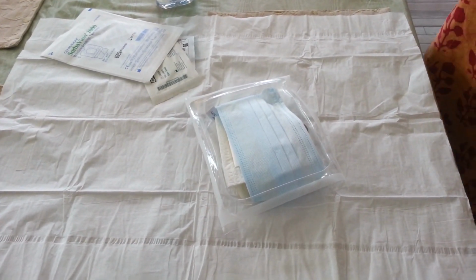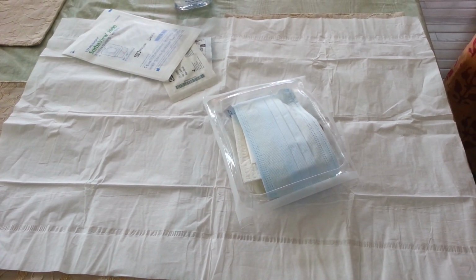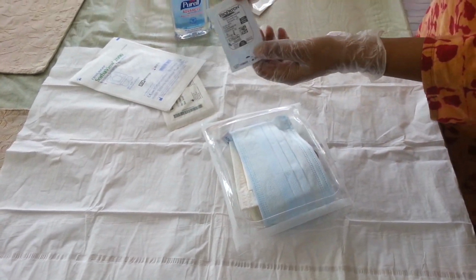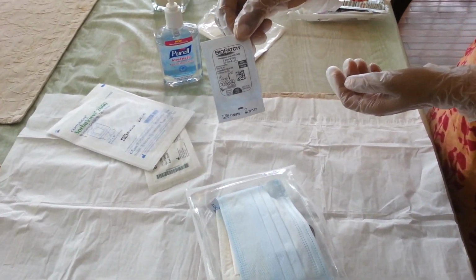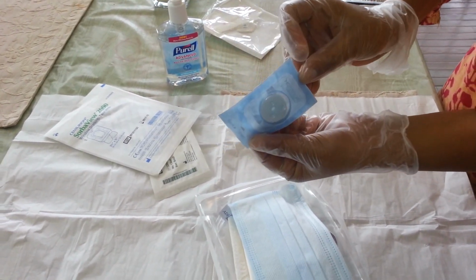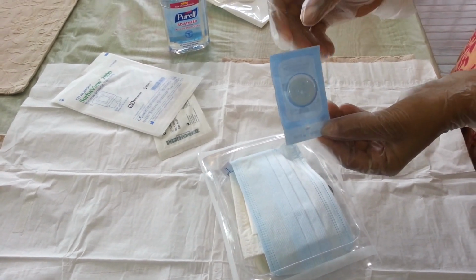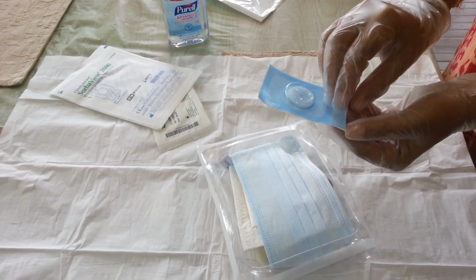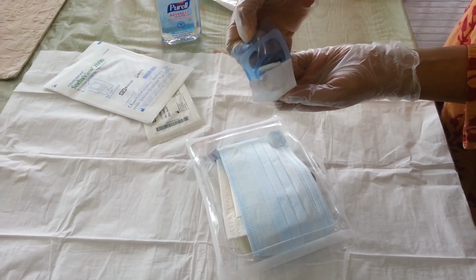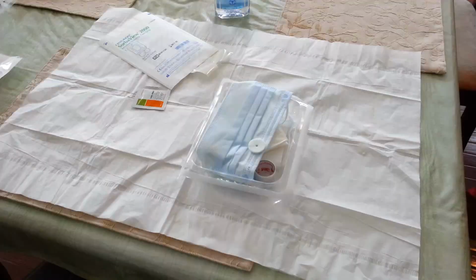Now we will add to the kit the custom supplies that we use, all the while maintaining sterility. This is a Biopatch. It's a tiny circular antibacterial sponge that is put around the insertion point of the Picc line. It contains chlorhexidine, which is a powerful antiseptic and helps prevent infections. Without touching the inside of the package or the kit, peel and drop it into the kit like this.